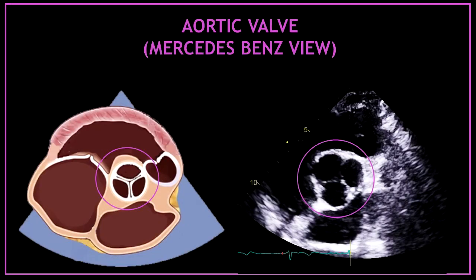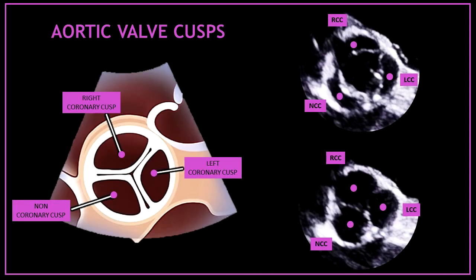This valve in the middle of this view is the aortic valve. When the aortic valve is closed it looks very similar to the Mercedes-Benz symbol, that's why this view is often called the Mercedes-Benz view. In this view we can differentiate all three aortic valve cusps: on the top you have the right coronary cusp, on your right hand side you have the left coronary cusp, and on your left hand side you have the non-coronary cusp.